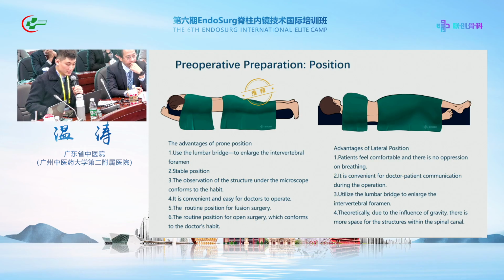But for the lateral position, some doctors think it feels comfortable with no pressure on the patient's breathing, and it will utilize the lumbar bridge to enlarge the intervertebral foramen.